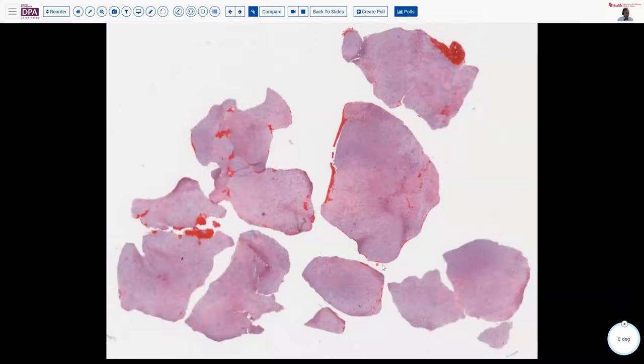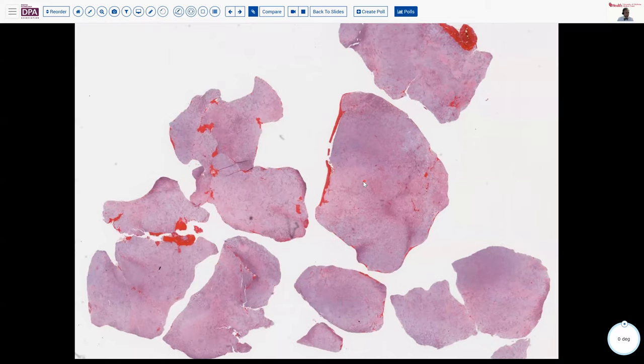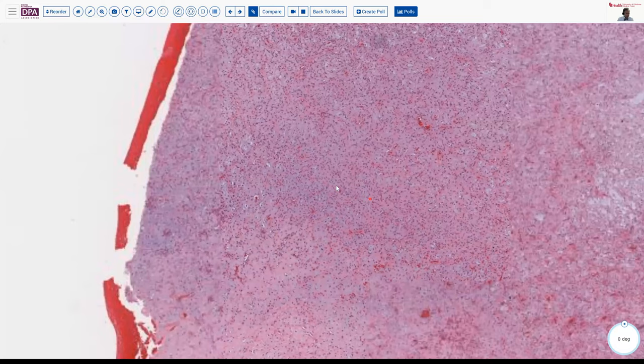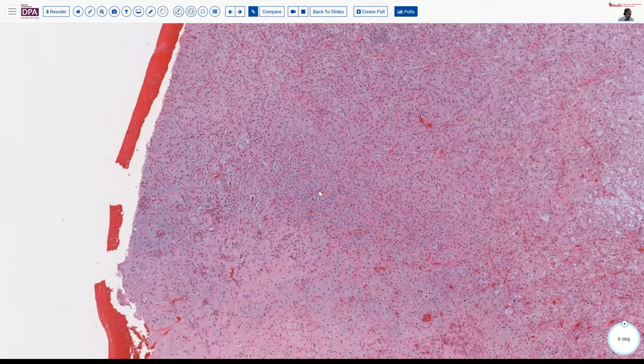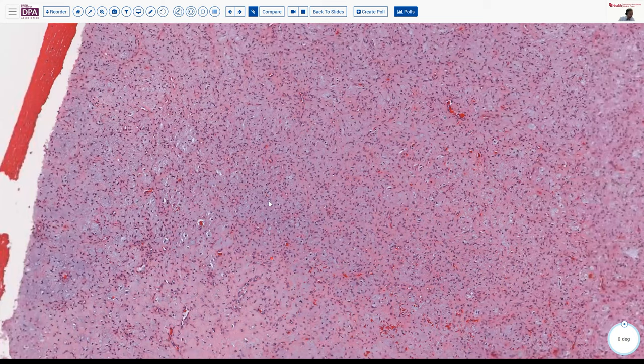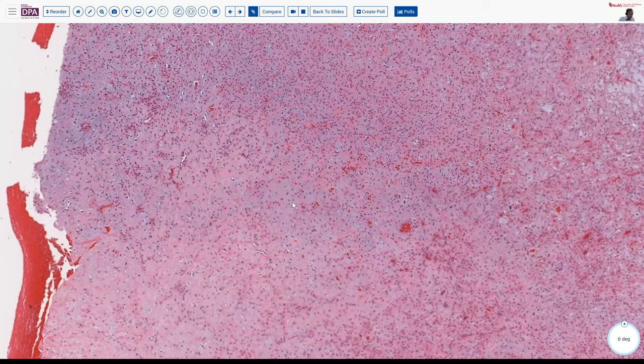And so here we're looking at the lesion. The tissue, what you see, has a vaguely uniform or mostly uniform appearance as opposed to those dimorphic things that we've thought about. And the tissue has a little bit of this blue chondroid-like matrix. So it's a very loose bluish matrix. And other areas look a little bit more myxoid, maybe we'd say.